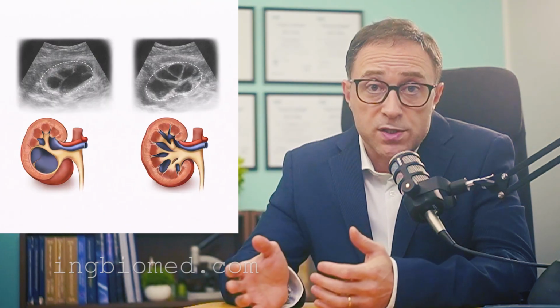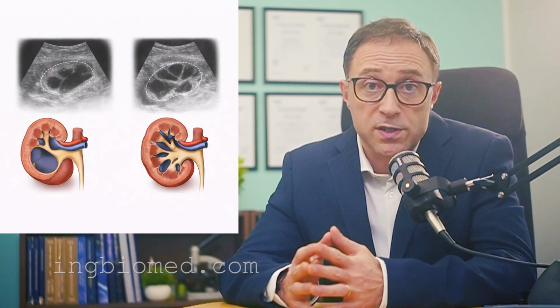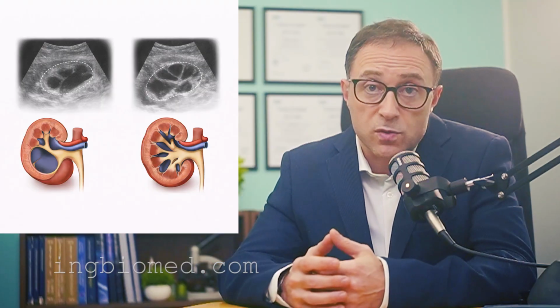Differential diagnosis is important. An extra-renal pelvis or prominent hilar vessels may mimic mild dilation. In doubtful cases, color Doppler helps differentiate vascular structures showing flow from static urine, which remains anechoic and avascular.